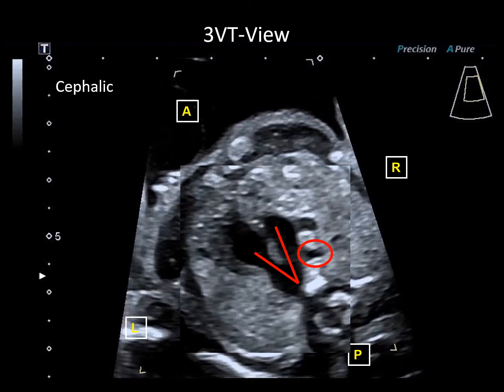Encircled there next to that V is the trachea, and what you need to note is that the trachea is a midline structure, and it's the landmark to show you what is on either side. Obviously the SVC here on the right side in front of the trachea, that's depicted as being on the right side of the fetus. The left side of the fetus is here, and both the ductal and aortic arches arch to the left of this trachea, which makes this a normal arrangement of a left aortic arch and left ductus arteriosus.